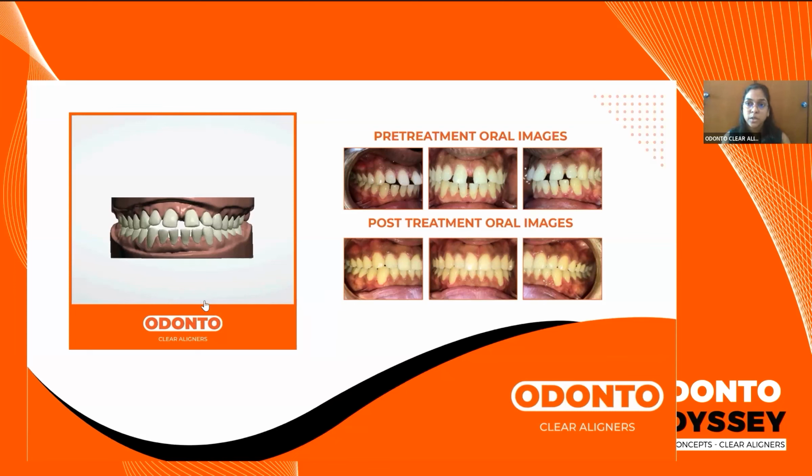Minimum set of aligners per case. This depends, it's multifactorial. It depends on the correction which the patient is looking for. If it is a mild case wherein there is only a diastema of say up to 1 mm, then the minimum case set can be 10 sets that we can look at. And yes, you could receive the recording. We'll have to speak with Mansi in case it can be provided, so that you have an idea regarding the same. Minimum sets are also in terms of how much movement we program into every aligner.